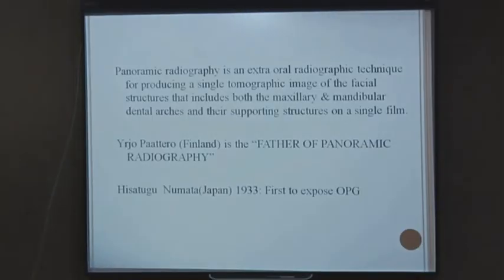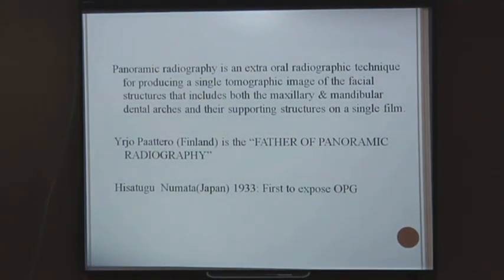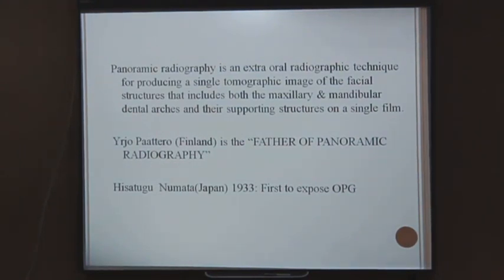Panoramic radiography. The last two lines were your MCQs, do you remember? Numata and Paatero, the inventors of your OPG. Yrjö Paatero is your father of panoramic radiography. You could probably put together a small handbook: authors, years and appearances, normal values. These are the things which are common for MCQs and the things which commonly tend to be forgotten.